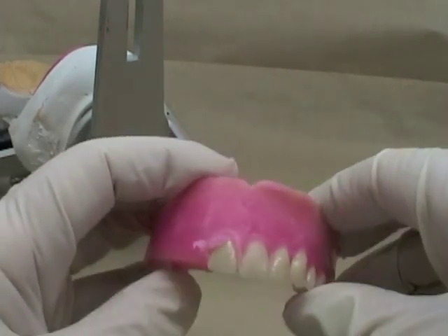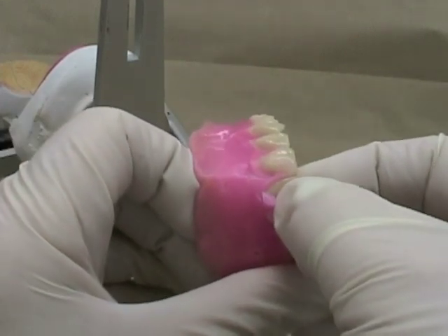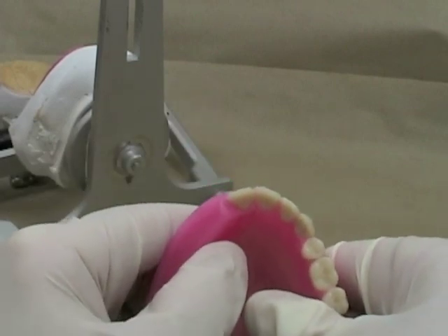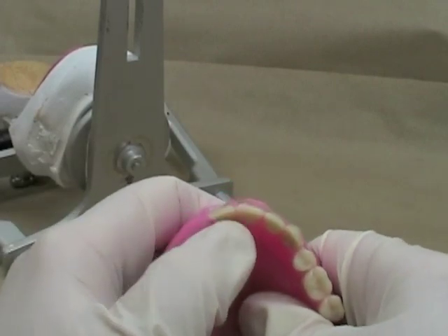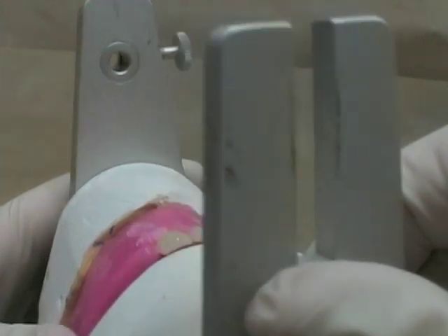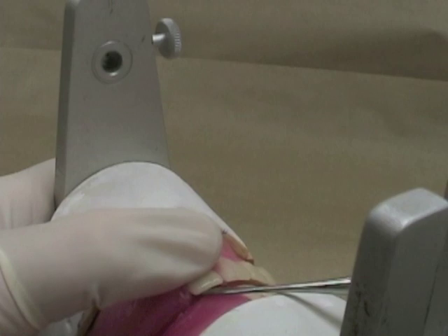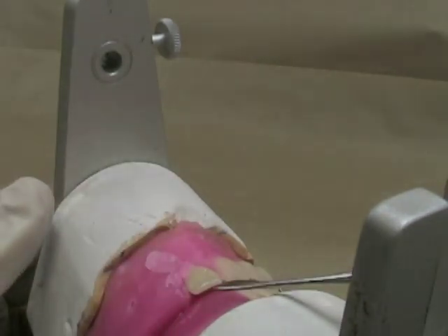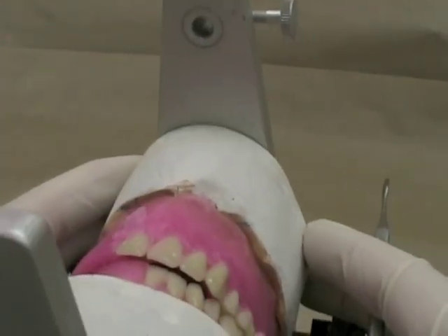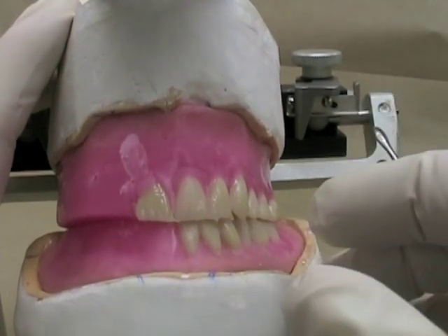I'll position it so that the incisal edge is even with the corresponding tooth that's already been set. I'll view it from above to make sure that it's close to being symmetrical, and I'll put it back on my cast to see how it relates to my ridge below. I can use my instrument to pry it apart slightly so that the overjet looks approximately the same as on the opposite side.